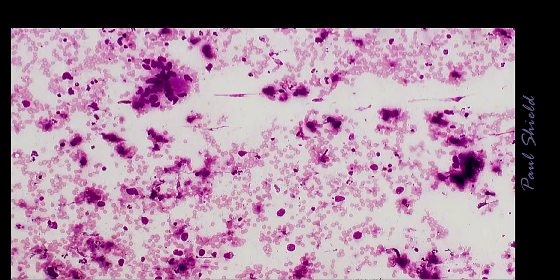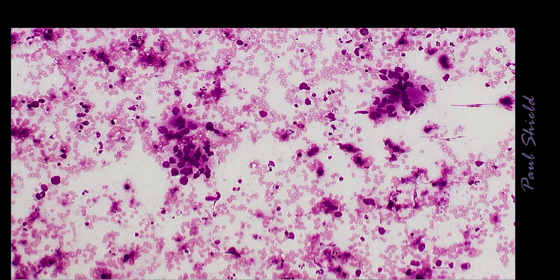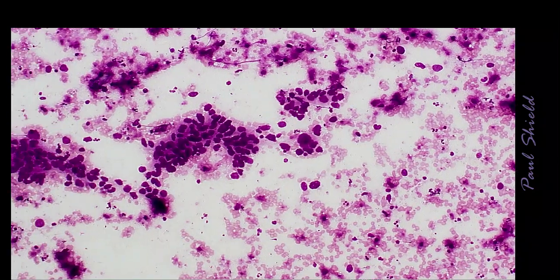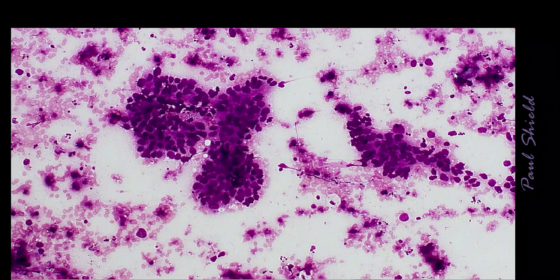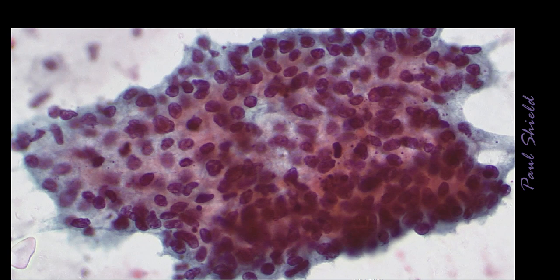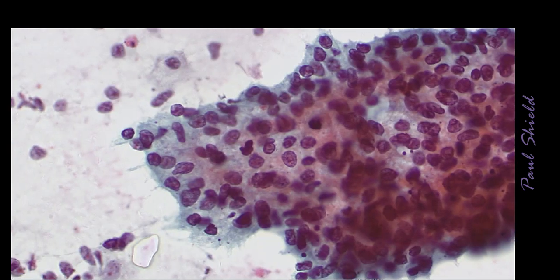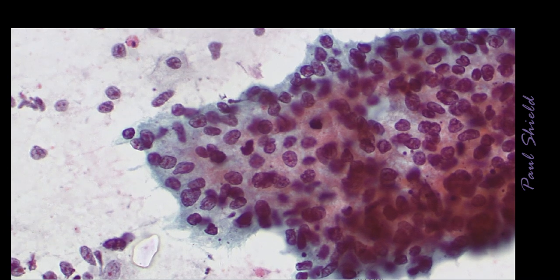This is another example. We've got large dark nuclei in the Giemsa and some groupings like this, which have a bit of a glandular look to them on low power, and that definitely has more of a glandular look to it. This is the pap stain fixed slide, and this is a much better sort of a well differentiated adenocarcinoma.